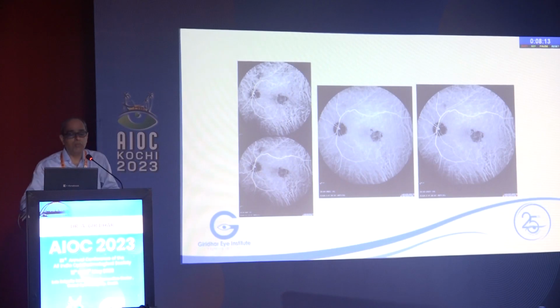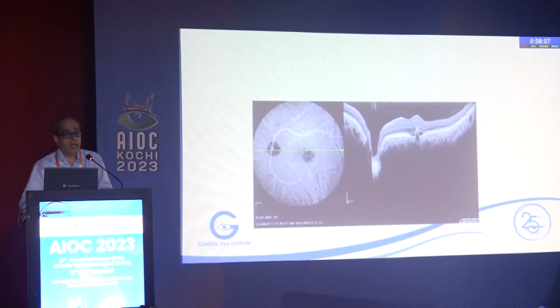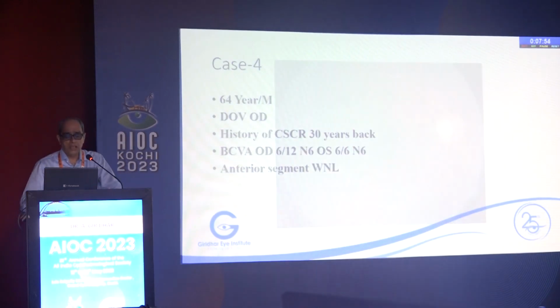This is a case of a polypoidal choroidal vasculopathy. Therefore, using multimodal imaging in this particular patient, we diagnose, you can see beautifully now, this is a classic picture, which beautiful pictures already Dr. Anand Rajendran has shown based on our work that we did many years together. So you can see that tall peak PED there. Now this is another patient.